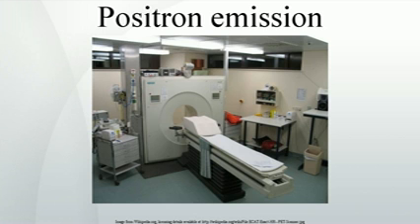Much more commonly, however, drug occupancy at a purported site of action can be inferred indirectly by competition studies between unlabeled drug and radiolabeled compounds known a priori to bind with specificity to the site. A single radioligand can be used this way to test many potential drug candidates for the same target. A related technique involves scanning with radioligands that compete with an endogenous, naturally occurring substance at a given receptor to demonstrate that a drug causes the release of the natural substance.